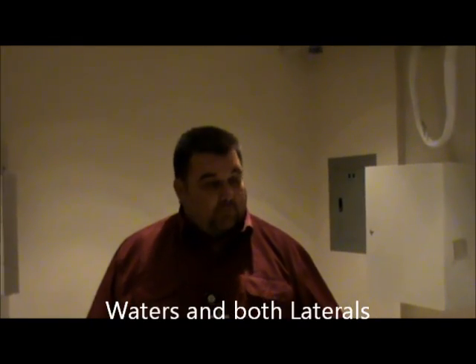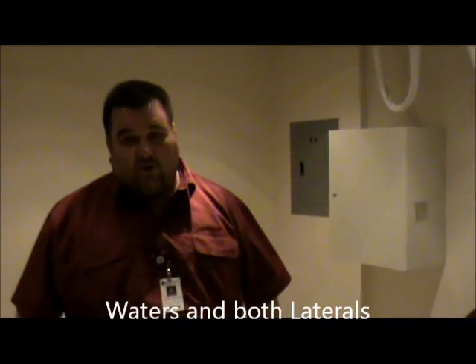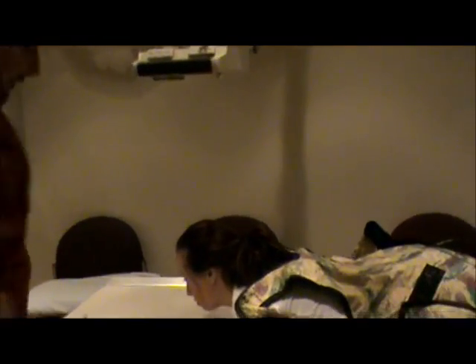Today we're going to be demonstrating nasal bones. The routine views for nasal bones will be Waters and both laterals. The first view we're going to do is our Waters view. We'll have the patient lay down and use a full body shield, with the center lock centered to our film.